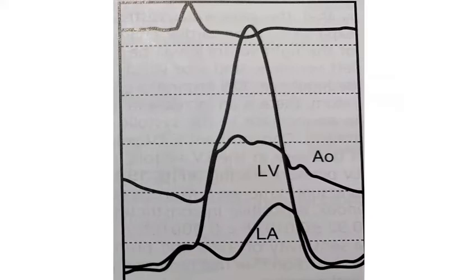The pressure tracing diagnosis. You have three tracings: LV tracing, aortic tracing, and LA tracing. Sir, a gradient is seen between the left ventricle and aorta. Yes, there is a gradient between the aorta and the LV. Due to what? Possibly a fixed obstruction. Fixed obstruction, okay. What about others? No, sir, it doesn't seem fixed, because there would be delayed peaking in aortic stenosis, a fixed obstruction. It looks like there is no delay, no delayed peaking, and it looks more like spike and dome.